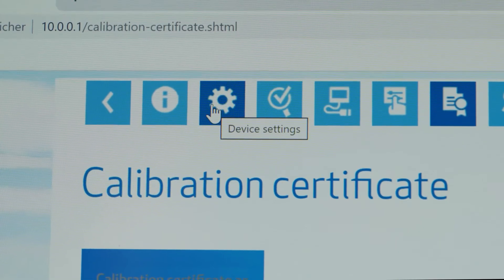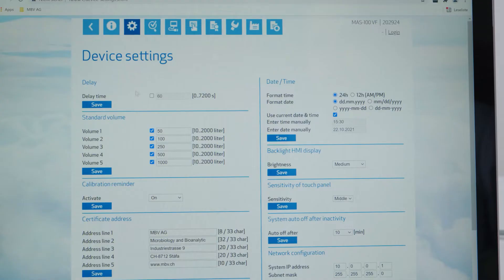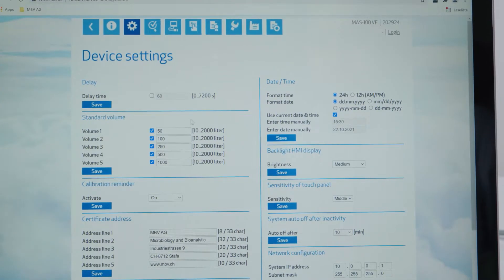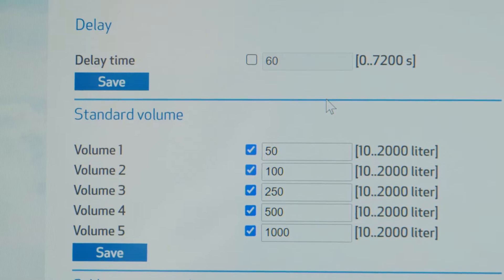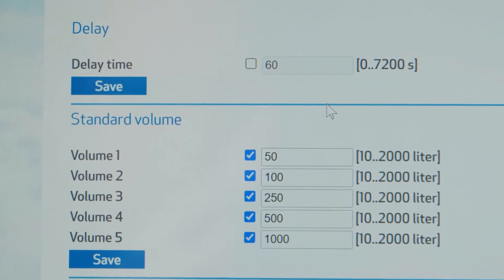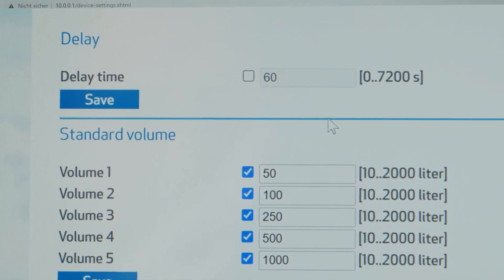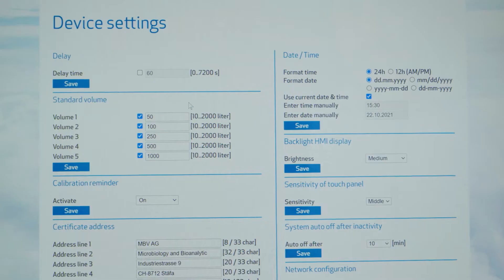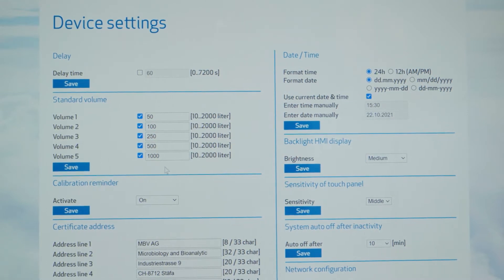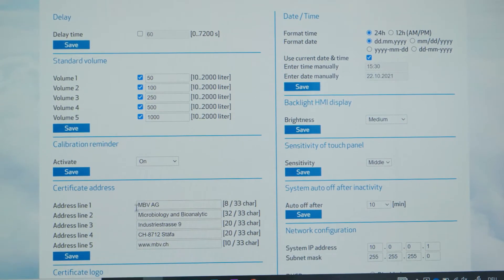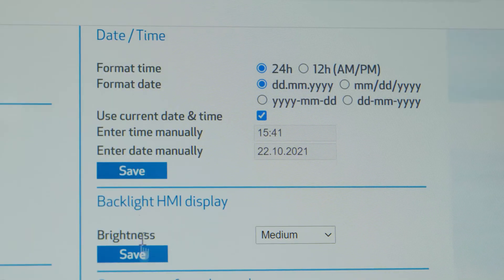And second, you can modify many instrument settings. These are for instance the delay time between pressing the sampling start button and the actual start of the sampling. You can also customize sampling volumes that are accessible from the keypad, the address and logo on the certificate, time and date settings, and so forth.